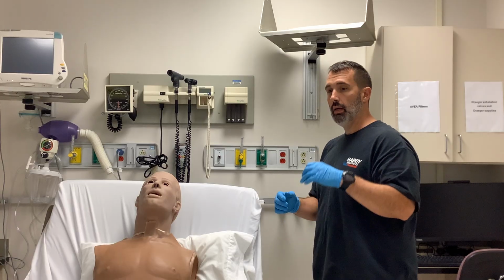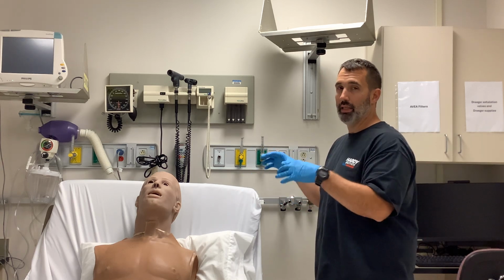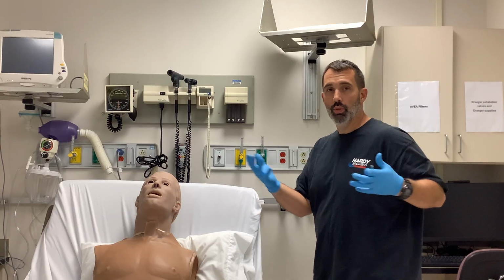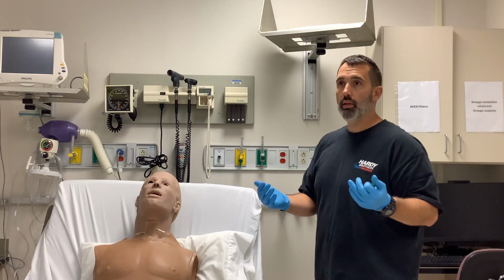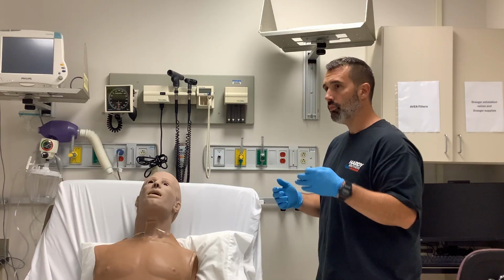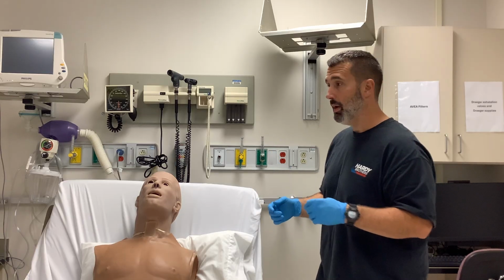I know we've gone over low flow devices as well as high flow devices in another video and in class. Today I'm going to talk about air entrainment and kind of how that works to an extent. But we have to understand the composition of the air that you and I are breathing in right now. The atmospheric air that we breathe in has close to 21% oxygen. The rest of it is 78 to 79% nitrogen with a very small percentage of other trace gases.